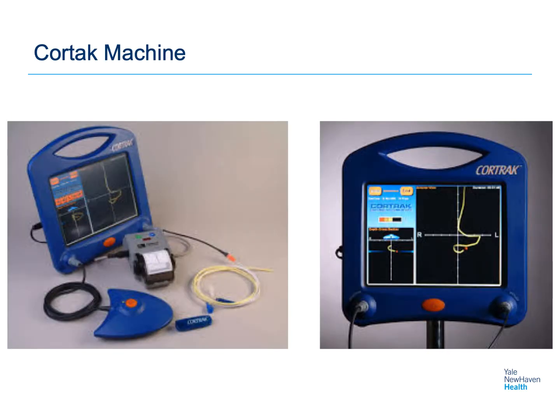This slide is a picture of the Cortrak imaging guidance machine. This is an electromagnet that allows us to see where the tip of the tube is during the insertion of the Cortrak tube. You can see the various components of that on the screen here, and all of those components are put on a stand that you would wheel to the bedside to use while placing the tube.